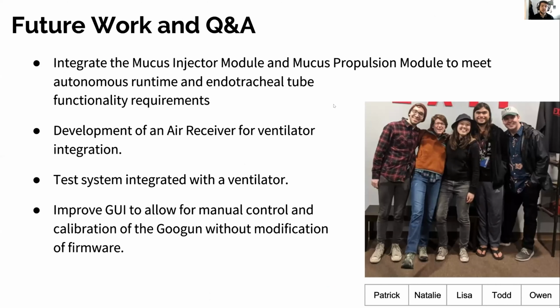If we had had more time to work on the project, there are a few more things we would have liked to have completed. The first thing is that we would have liked to have fully integrated the mucus injector module and mucus propulsion module together. Integration would allow for us to test with a minimum autonomous runtime and endotracheal tube functionality requirements.